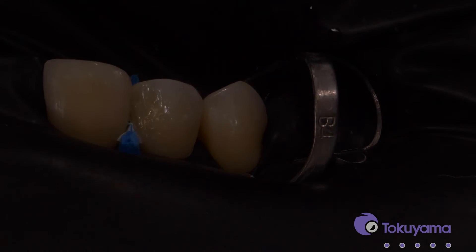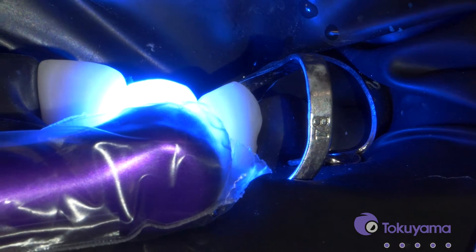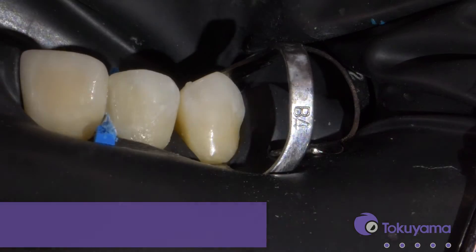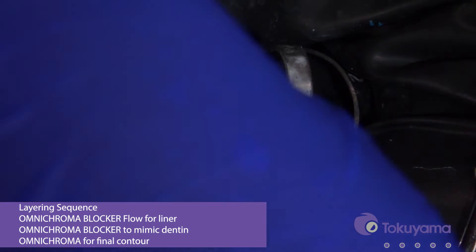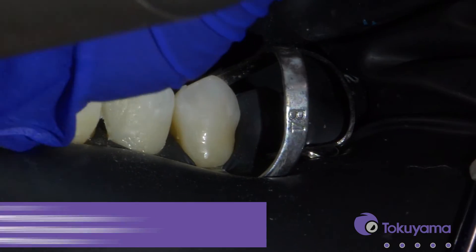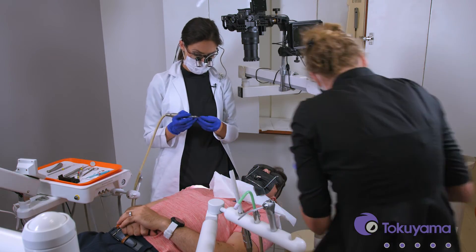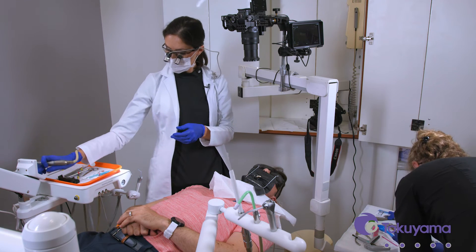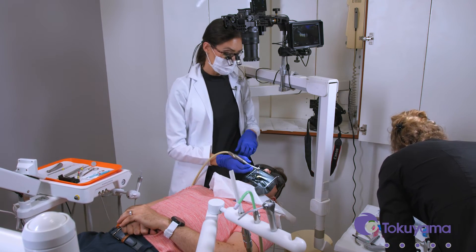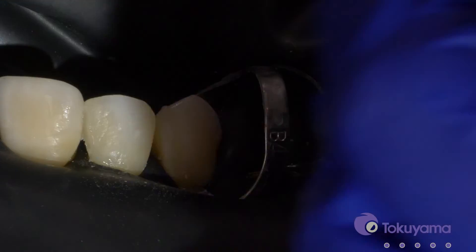Let's cure that. Now that we have that layer built on, we'll just start with the polishing. I like these soft flex discs, so I'm going to just start getting some of that anatomy.